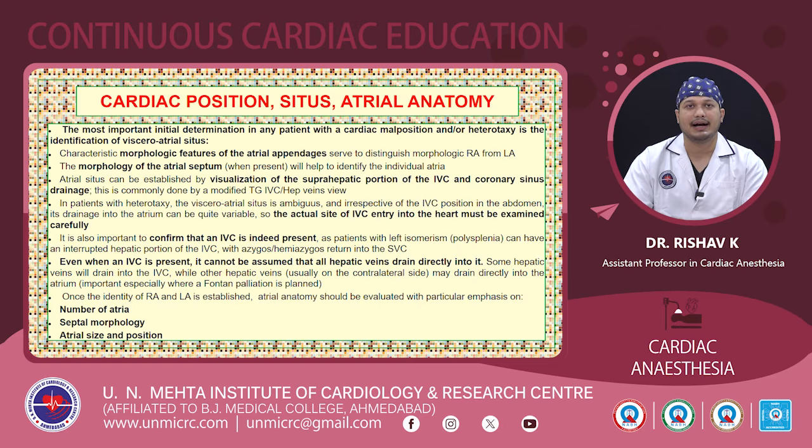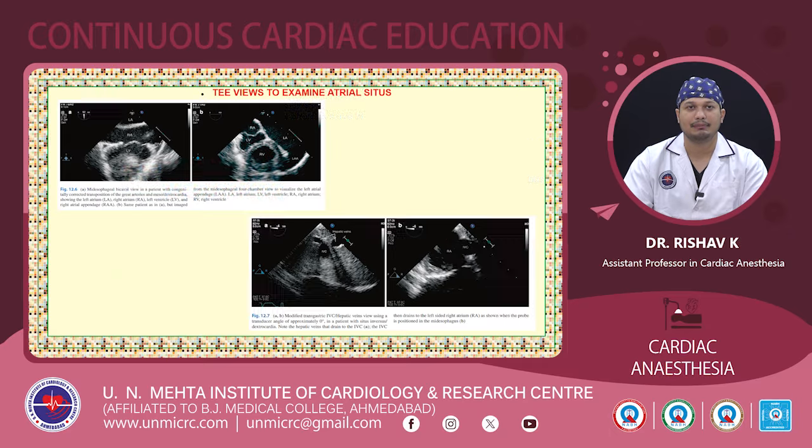Once the identity of the RA and LA is established, the atrial anatomy should be evaluated with particular emphasis on number of atria, septal morphology as well as the atrial size and position. So these are the different TEE views that we can use, and in this case we are seeing on the top left the midesophageal bicaval view.